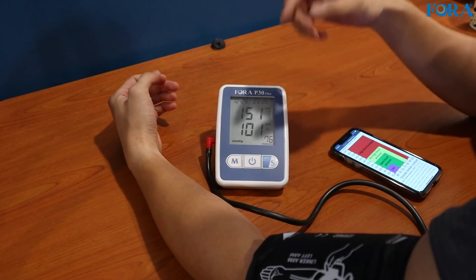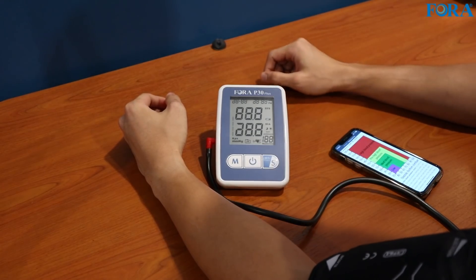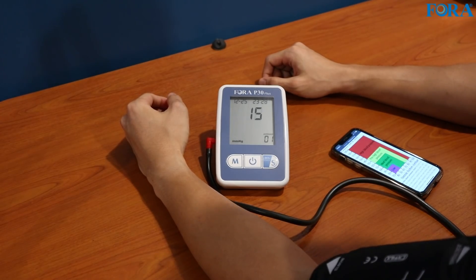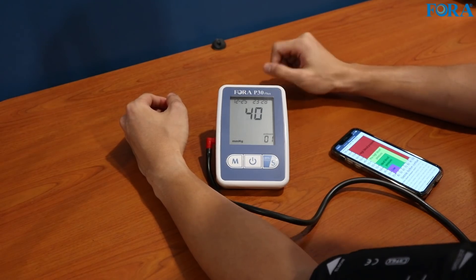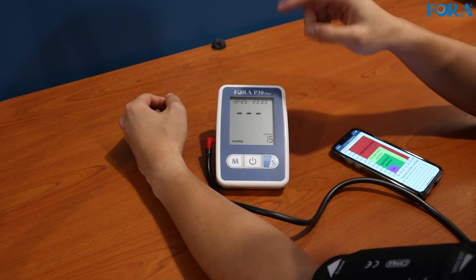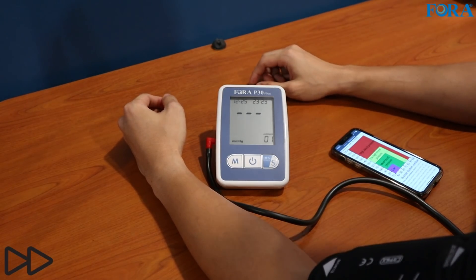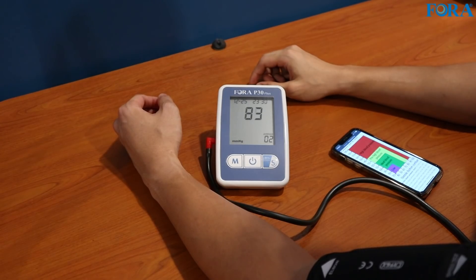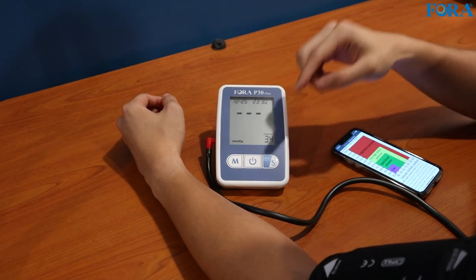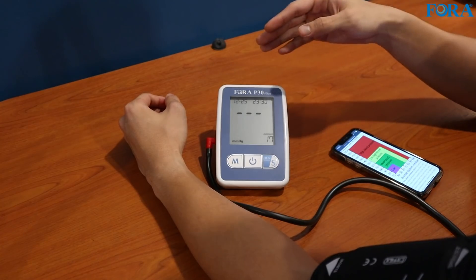We'll do a couple more readings and try the averaging feature — try noticing how silent the device is. Press this button. Did you guys notice that the reading is quite fast compared to other devices? So it's silent and fast. So that was the first reading. If you notice at the bottom right, there's a counter for the next reading. That was the second one and we've got a longer timer for the third reading. I like this feature — it's very thoughtful how the three readings are spaced out after each other.